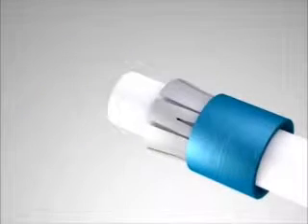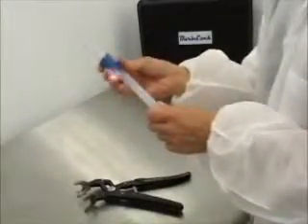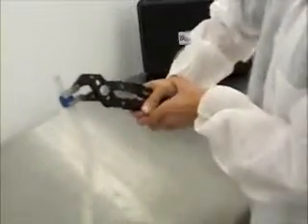Slide the pre-locked sleeve and collet on top of the tube. Insert the barbed fitting into the top of the tube and slide the pre-locked sleeve and collet over the barb until the collet base is flush with the top of the tube. Using the hand tool, lock the assembly into place.